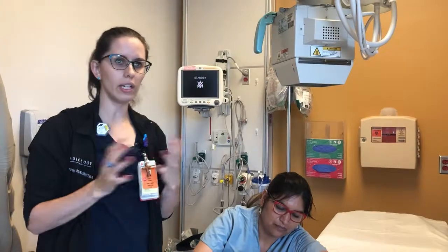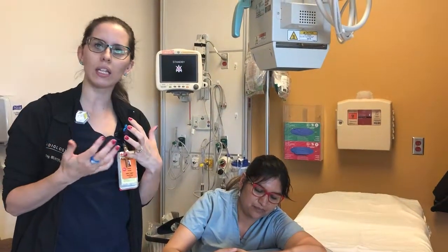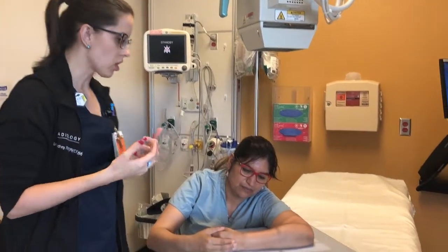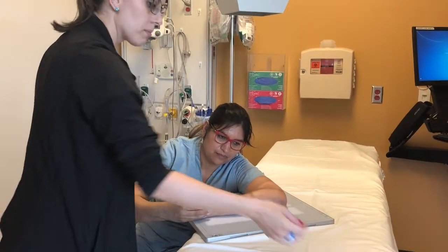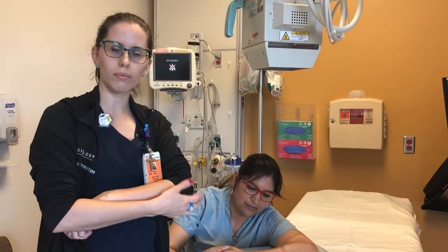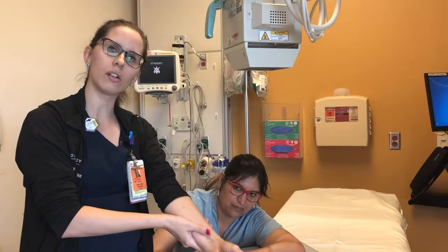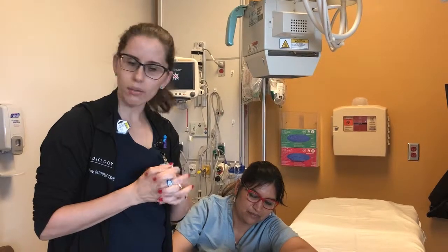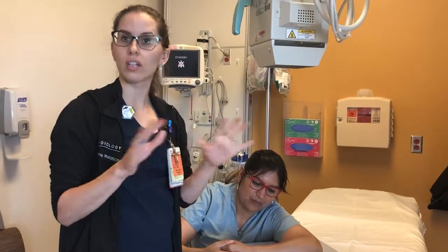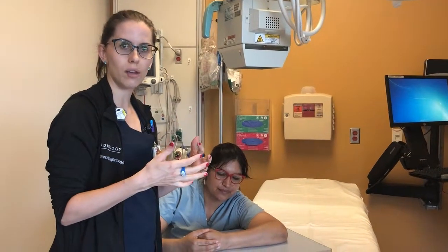Okay, so very easily from this, you know, when patients are in pain, again, it's very simple to talk to patients, and it just takes time and practice to get them going from that guarded lateral position, rotating their arm up a little bit and kind of relaxing their arm down. I've had maybe a handful of patients that I haven't been able to do that, and that was just due to their fracture itself. But a lot of our patients, we can go ahead and talk them into this AP position.